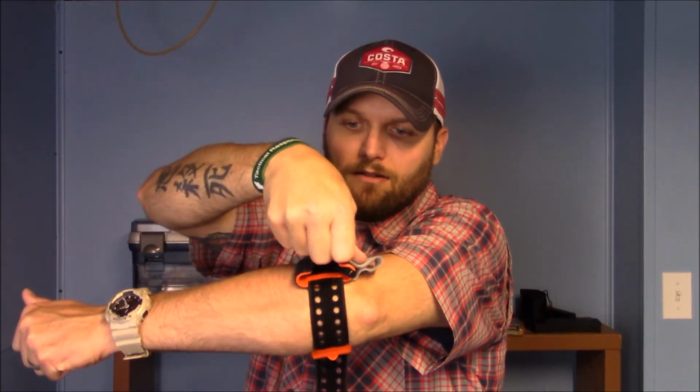So anyway, again, this thing would just be staged like a normal tourniquet. It folds up to actually a smaller size than the cat tourniquet. The soft tee gets pretty small, probably smaller than this, honestly. But this gets fairly small. But anyway, again, when you go to deploy it, grab that strap, you start cranking until it clicks. Once it clicks, it's held in place with an insane amount of pressure. Then you would begin wrenching that windlass down, lock it in place in the notch there, pull this over, and then of course again you're placed to write your time.